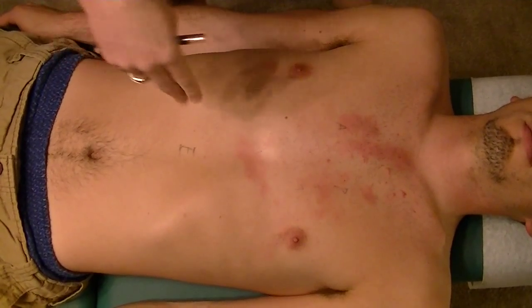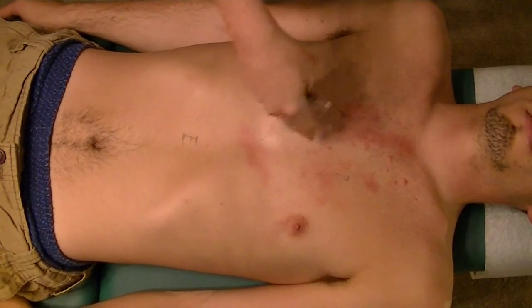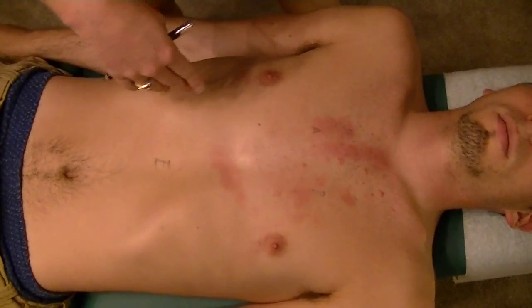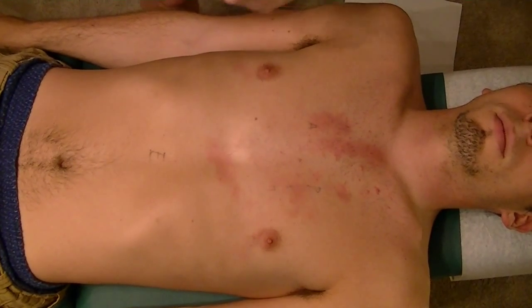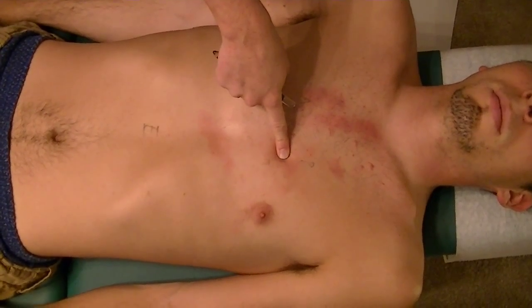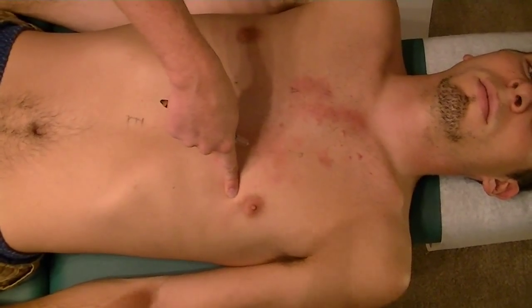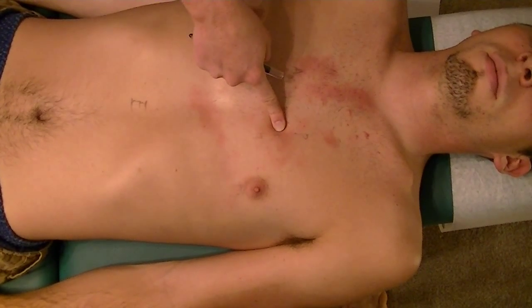And then for the female, you're only doing 2 areas, only at the third and fifth, obviously because breast tissue makes it harder to check for the tricuspid area. So we'll start off, since he's a male, we'll do the 3 areas there. We'll start from the lateral side. We're doing 4th, 5th, so right here. So 4th intercostal space is Erb's point, the 5th being the tricuspid, and the 5th one, I might have just said that wrong, but the 5th one is mitral. Erb's point, not epigastric. I said that wrong. You know what I mean, though.